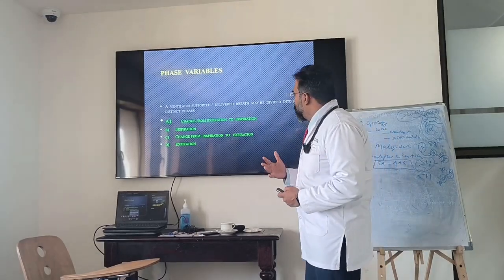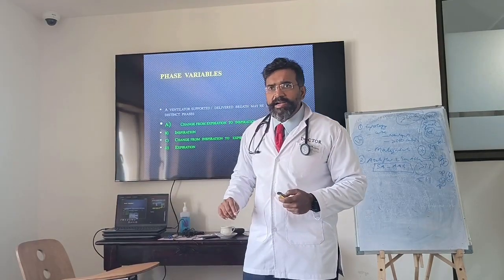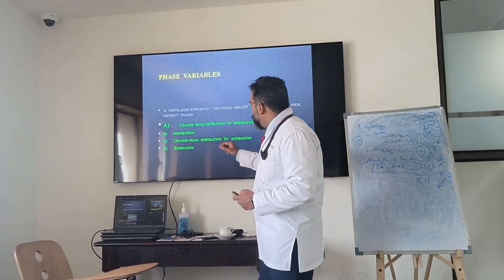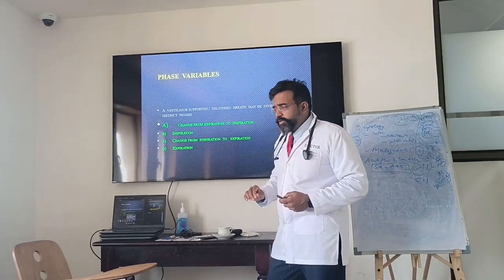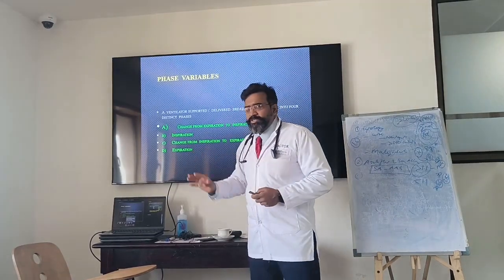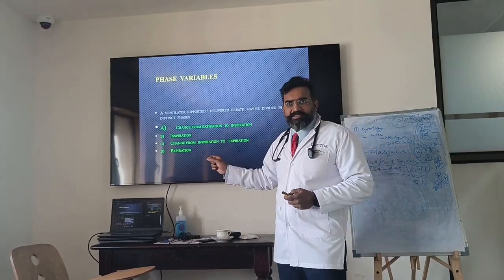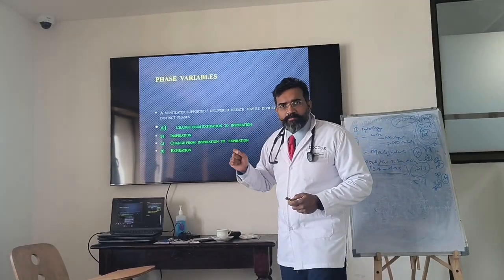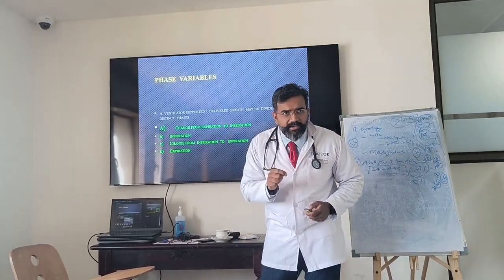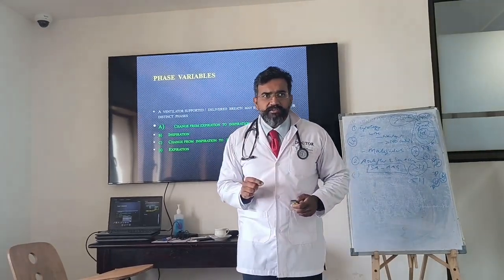First, most important, a ventilator breath is normally divided into these 4 phases. Which are these 4 phases? Change from expiration to inspiration, inspiration itself, change from inspiration to expiration, and expiration. The ventilator decides this, or you decide this. The entire settings are based on these 4 things. Everything that is set on the ventilator is based on these 4 things.